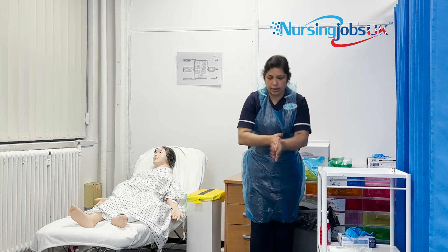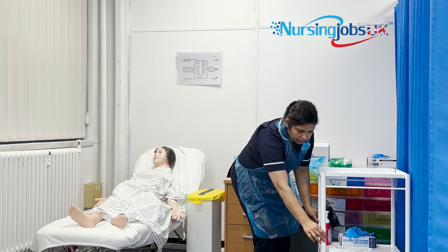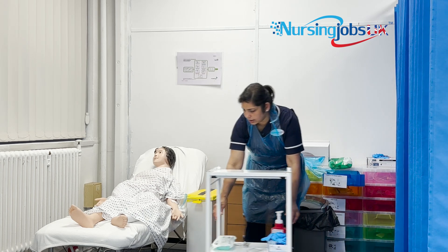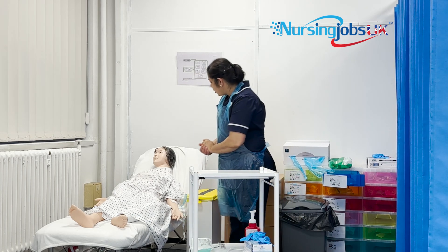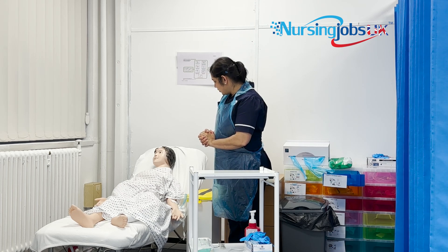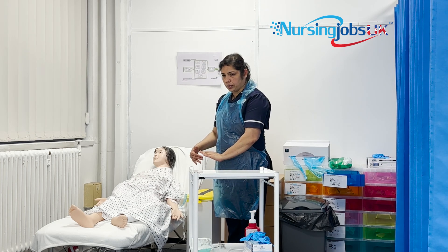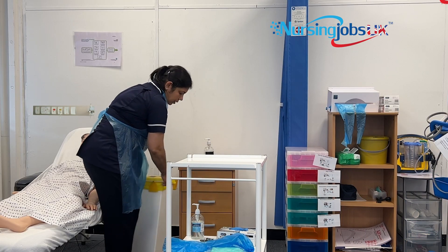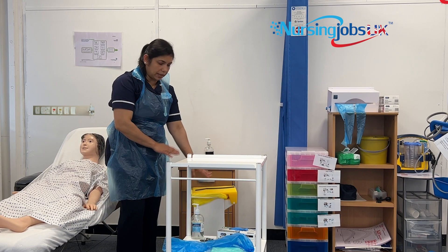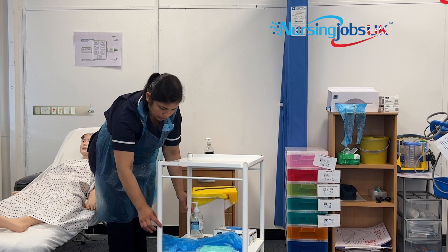Gel the hands again, then bring the trolley in by touching the middle of it. Joe, I'm back with the equipment — are you comfortable? Can I proceed? Arrange the trolley conveniently for yourself and position your clinical waste bin close by so it won't get in the way.